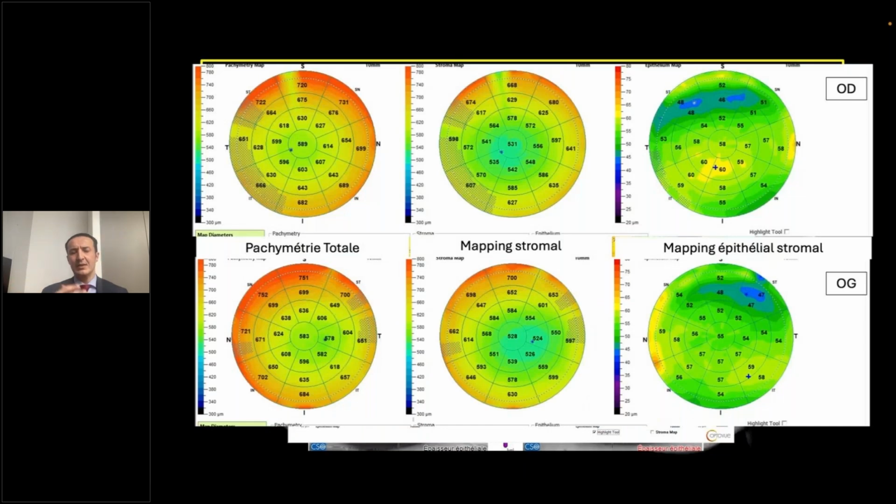And this is the new display of this patient with a scale here of 5 microns. That's why you have to click on the normalized ETM to obtain an adjusted scale of 2 microns to highlight the small changes of the epithelium.